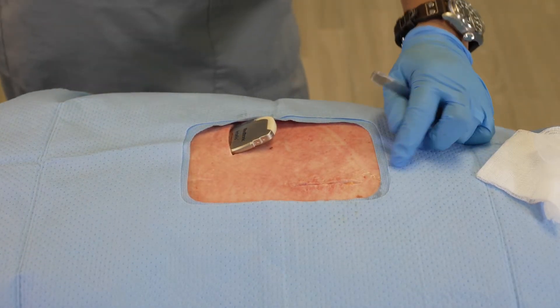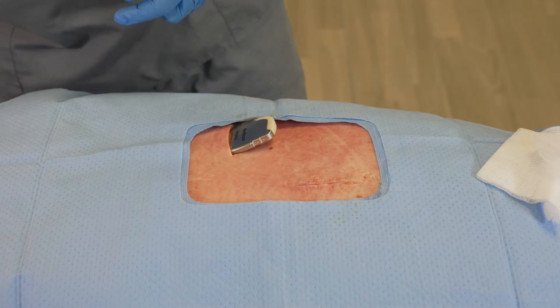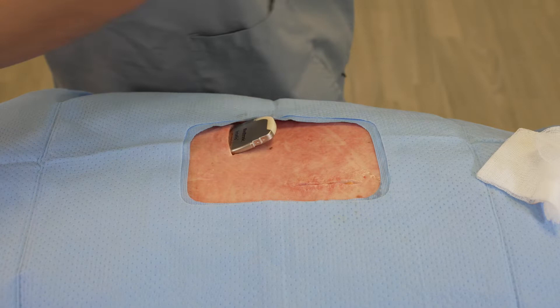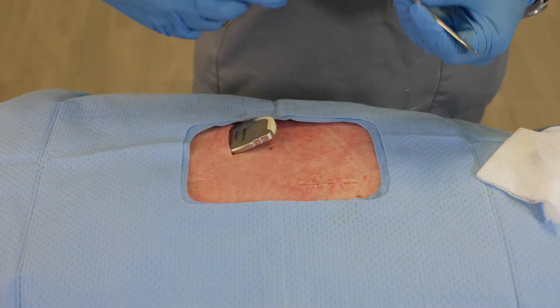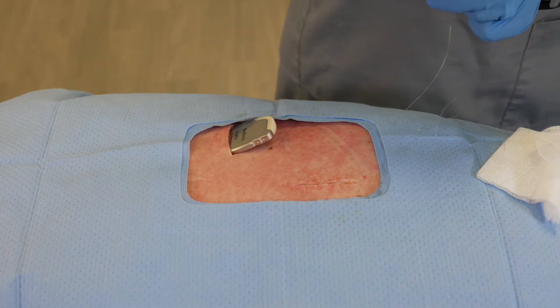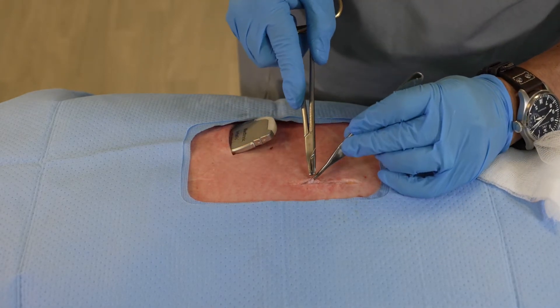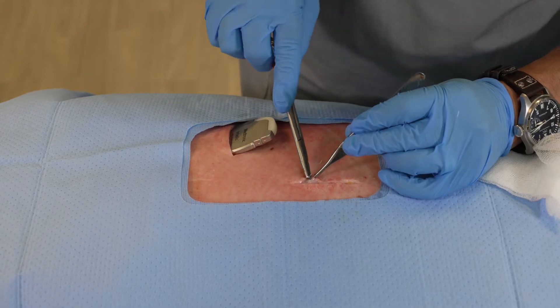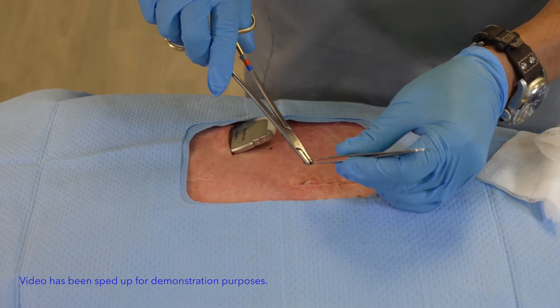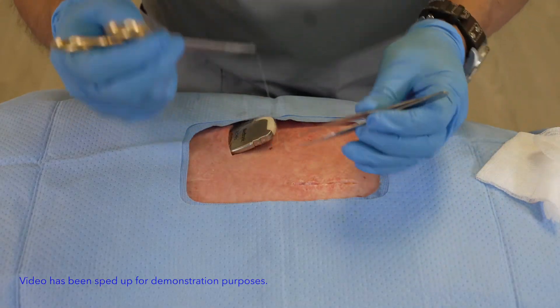The next layer is done in essentially the same manner. I use a smaller suture — in this case a 3-0 — and in the same manner I do my first loop creation, bringing the superficial tissue here to the apex. Again from the apex, I'm going to return back in the other direction.